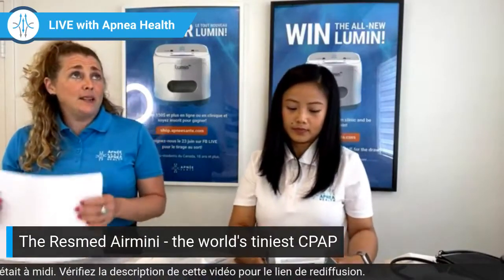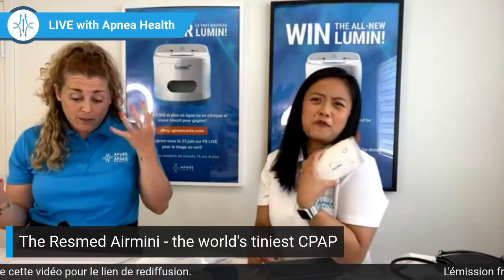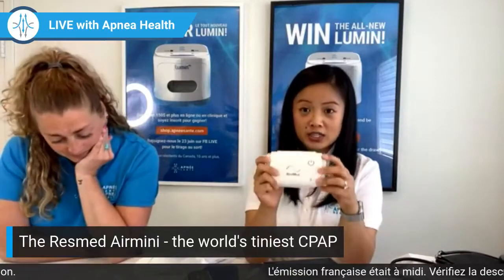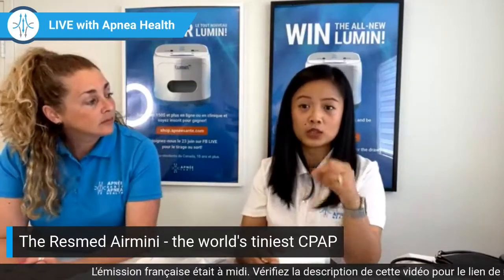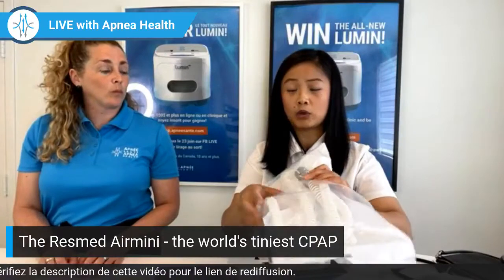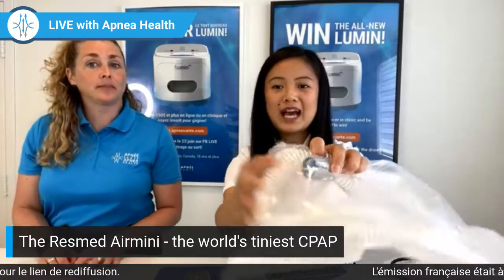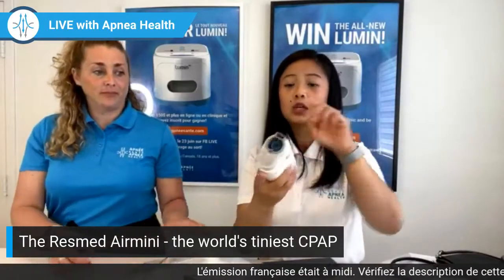I have to say, it's just the smallest CPAP. There has to be some kind of limitations. Is there limitations? Unfortunately, yes. Kim, there are some limitations. And this is due to how specific the tube was made. ResMed made it so that it's not like a regular tube you're used to seeing. It has its own specific adapter that attaches to the Airmini.